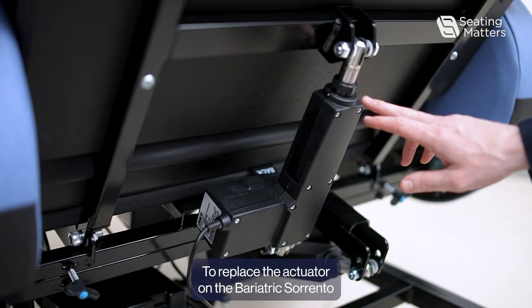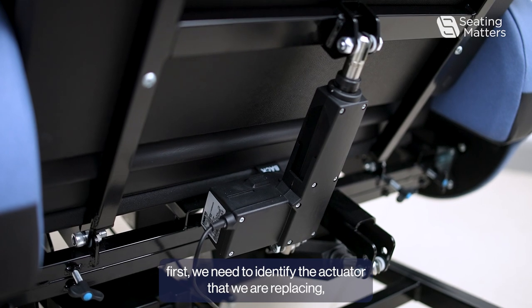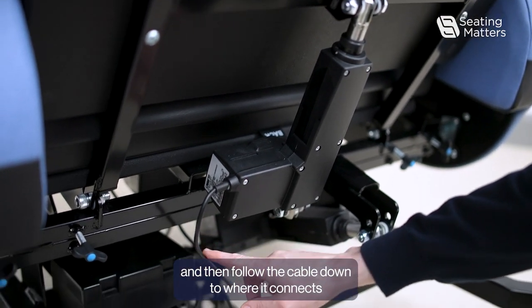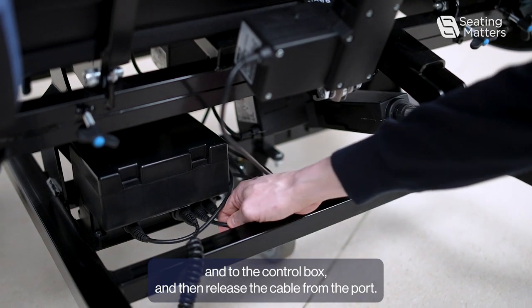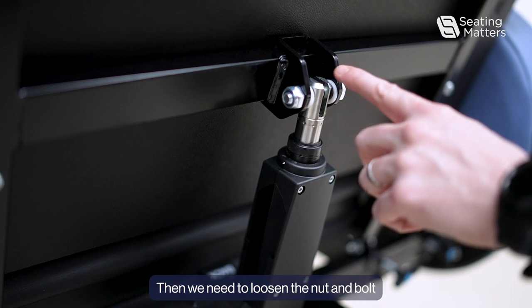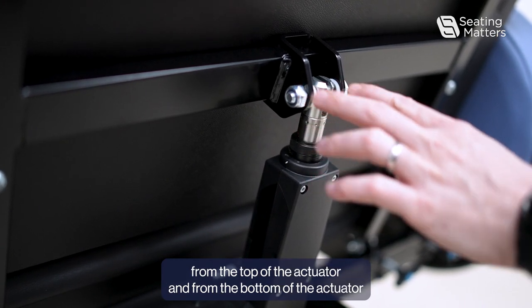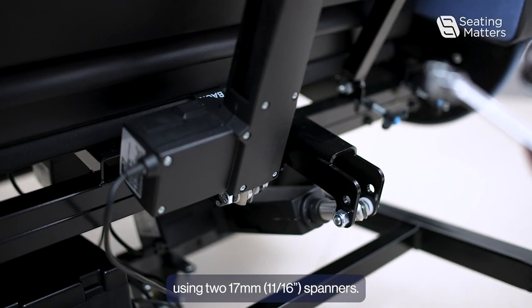To replace the actuator on the Bariatric Sorrento, first we need to identify the actuator that we are replacing, and then follow the cable down to where it connects into the control box and release the cable from the port. Then we need to loosen the nut and bolt from the top of the actuator and from the bottom of the actuator, using two 17mm spanners.